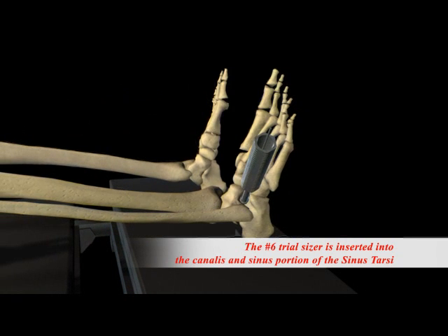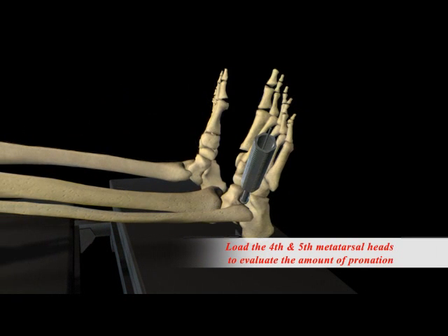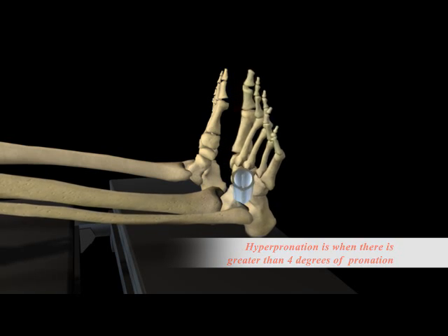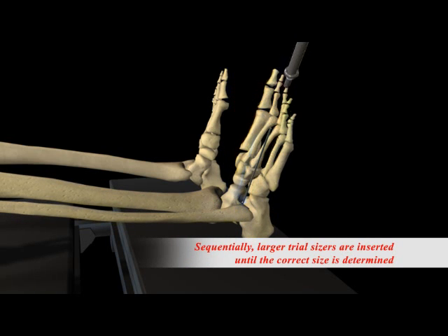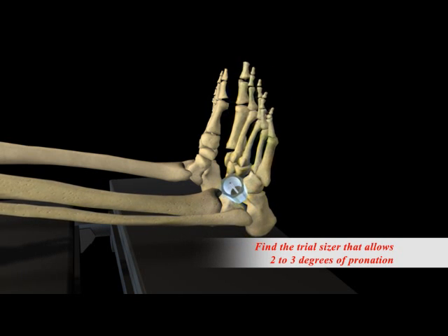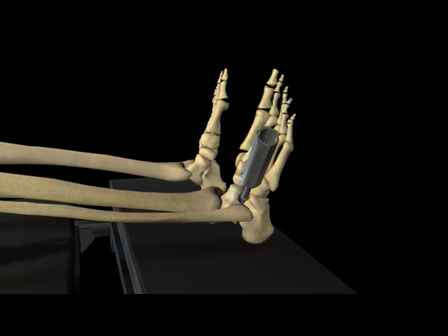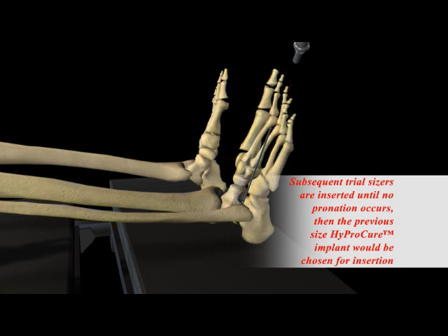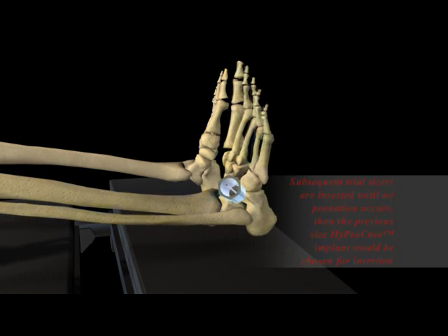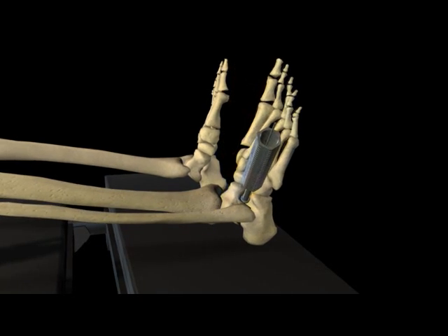This will determine which size HyperCure stent will be used to stabilize the talus and the tarsal mechanism. The surgeon will put the foot through a range of motion, and the goal is to have some motion occurring — not limited and not excessive. The average amount is about 4 degrees of pronation. The various trial sizers make the sizing process streamlined and very efficient, unlike other devices on the market which can lead to further trauma to the tissues. Once the size is determined, it is then placed onto the guide wire.